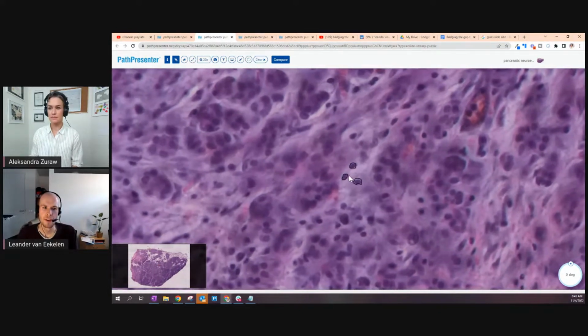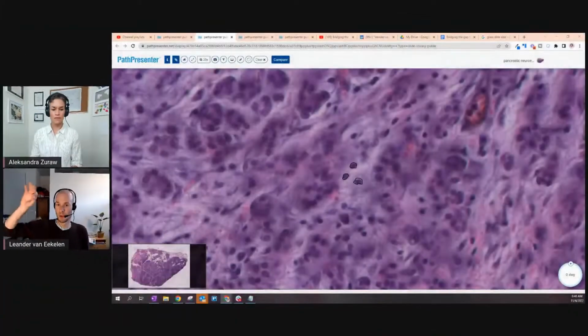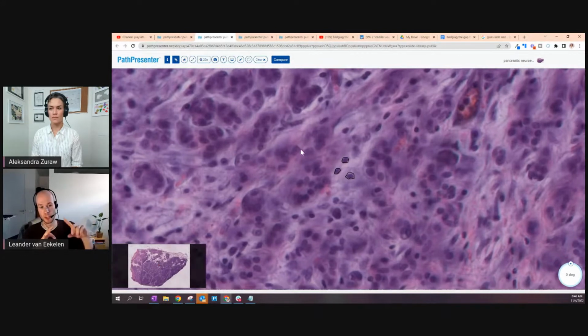The most intuitive, I think, is something that we call semantic segmentation. Yes, let's talk about that. Maybe a very quick step back. In a segmentation task, or in any computer vision task in general, we are interested in certain objects of interest, or maybe I can also use the term labels. In detection or segmentation tasks, we might be interested in cell type A, cell type B, and cell type C. And then my segmentation algorithm produces a map or an array with each pixel being labeled as either cell type A, cell type B, or cell type C.